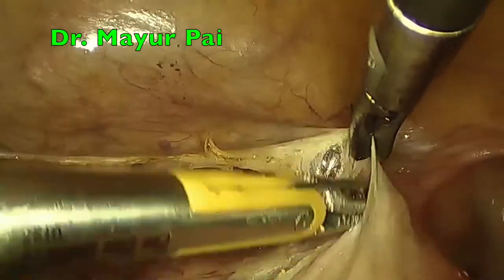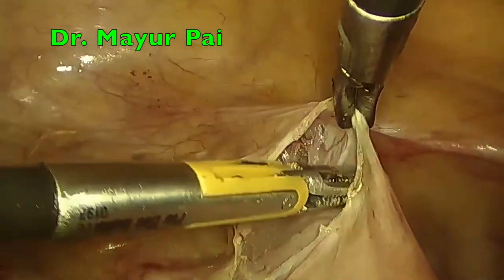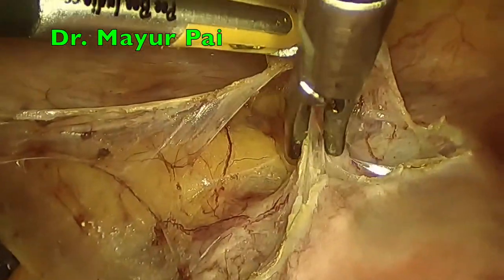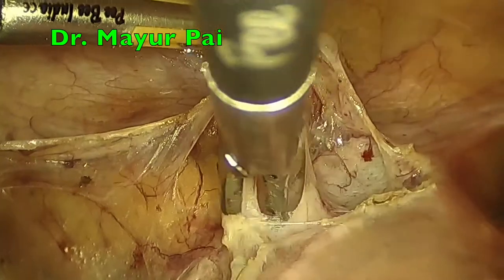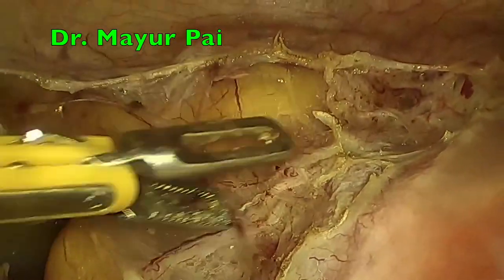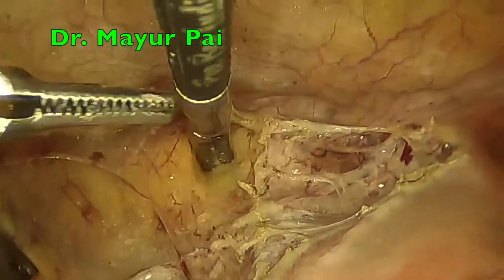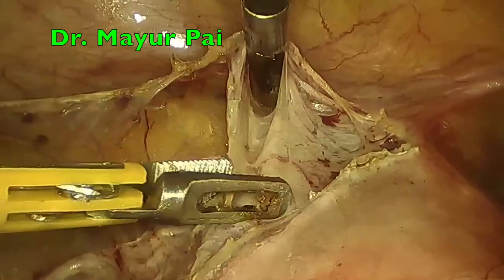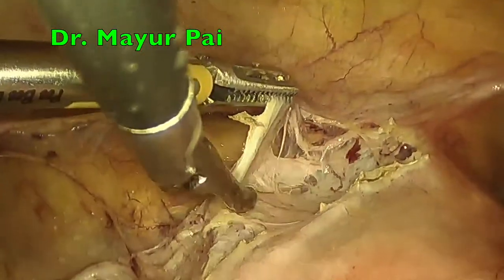We can see that the CO2 insufflation goes into the tissue planes, which further helps in mobilizing the bladder beautifully. As we proceed from left to right, we can see that the bladder is mobilized downwards beautifully. The trick of the dissection is to give traction with one hand and help in pushing with the other. Any adhesions that may be encountered sometimes require to be released with the help of cutting current.